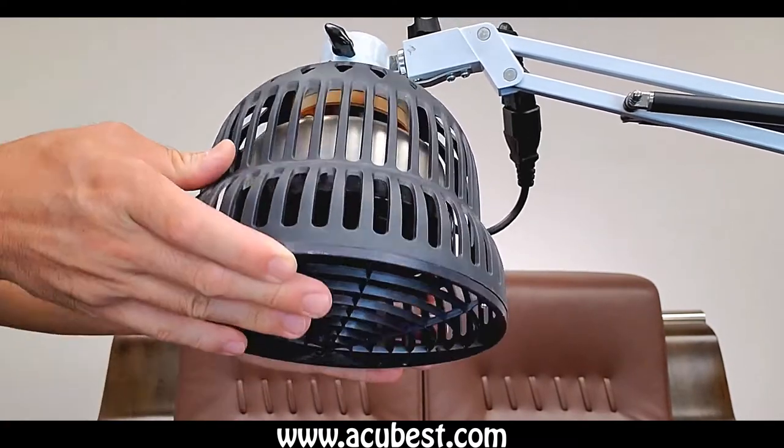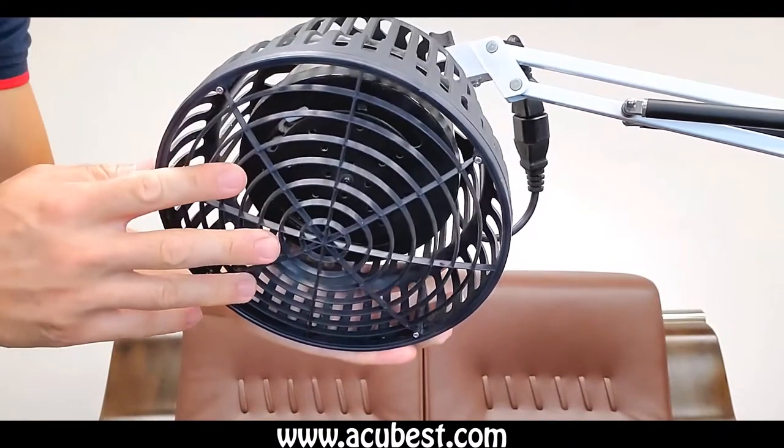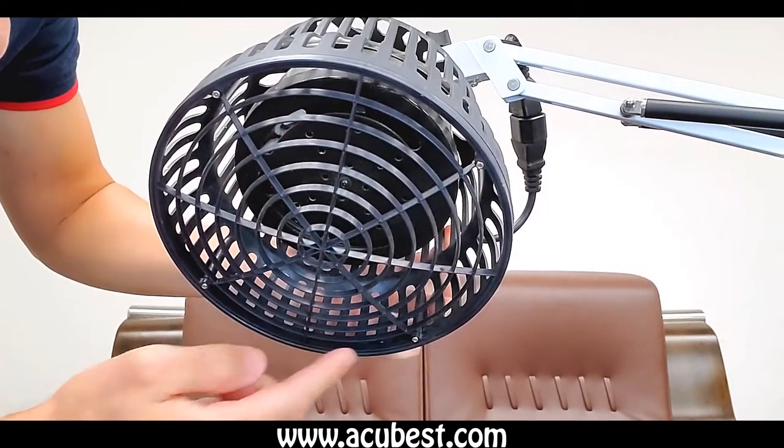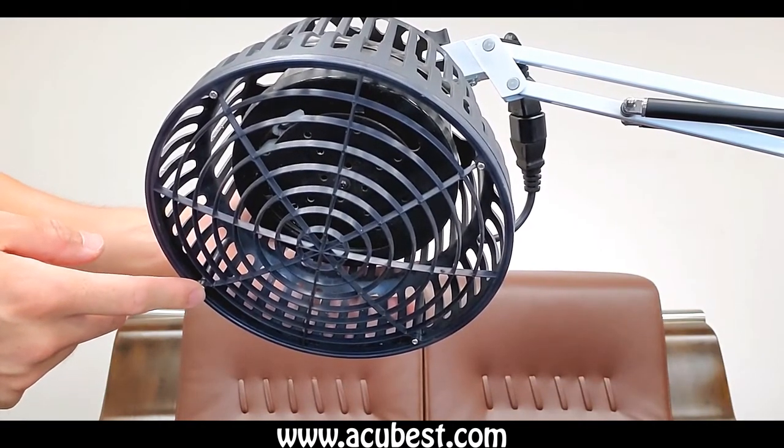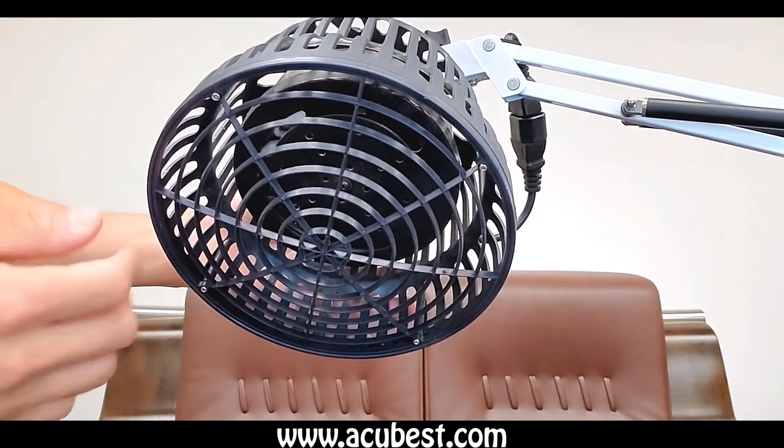Next I will dissect the lamp head for you to take a look at what's inside. On the bottom you can see there are four little screws holding the metal cover, and I will unscrew each of them to open it up for you.